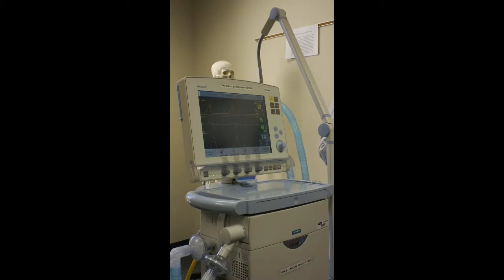And then inspiratory rise time. The rise time is typically on a pressure control breath, and it has to do with, so this is our I time here. You guys see that? Sorry. This is our I time here. Rise time is this. How quickly do I get to this? This is rise time.